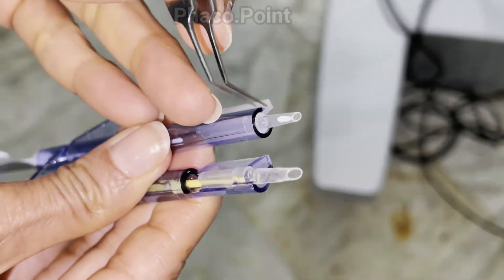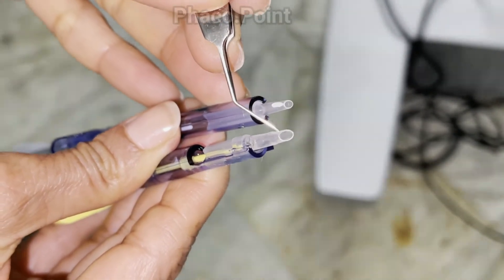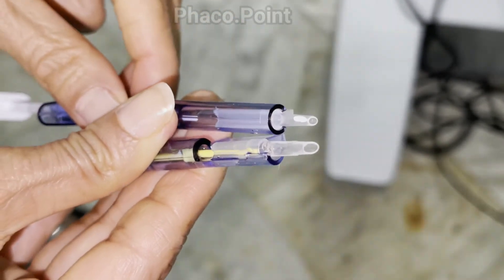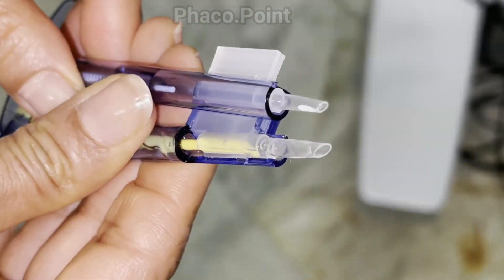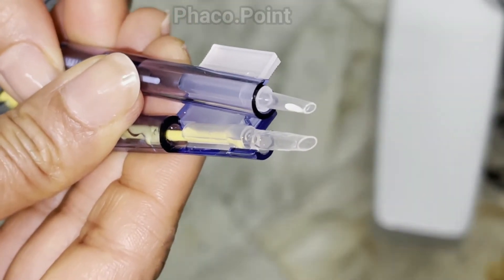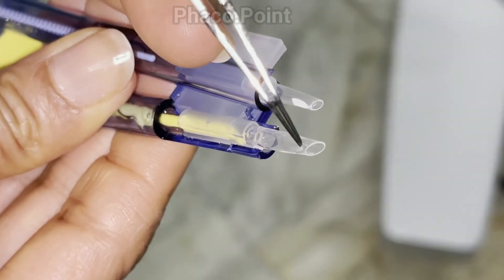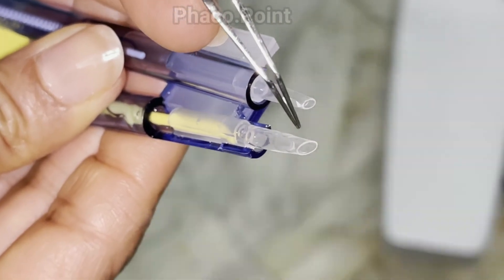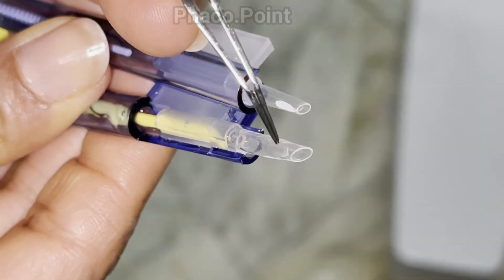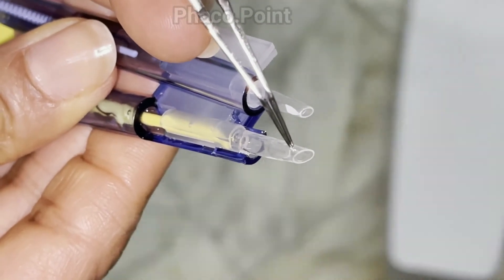The difference in the circumference of the nozzles — the part that actually enters the incision — helps us understand why we need a significantly larger incision to introduce the nozzle for IOL insertion of a three-piece lens. A decently sized incision of 3.2 or even 3.4 to 3.6mm is recommended to allow no chance of distorting the wound while inserting this lens.